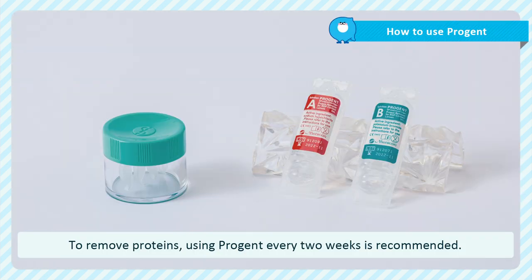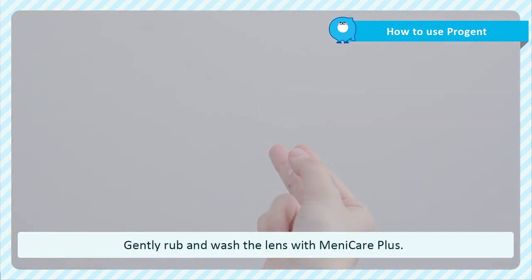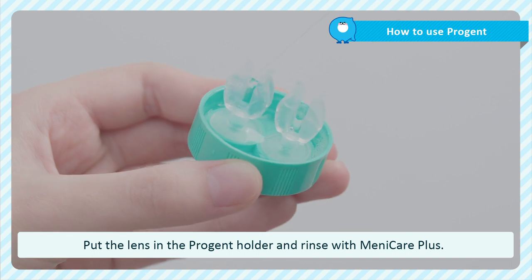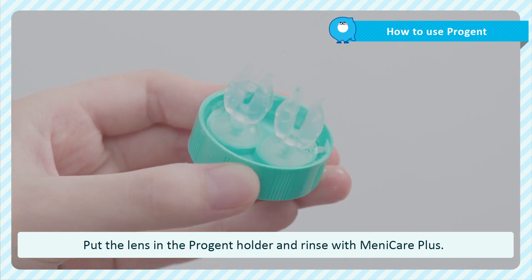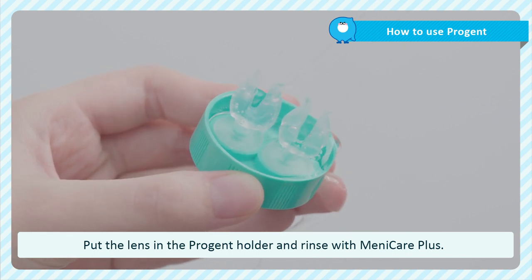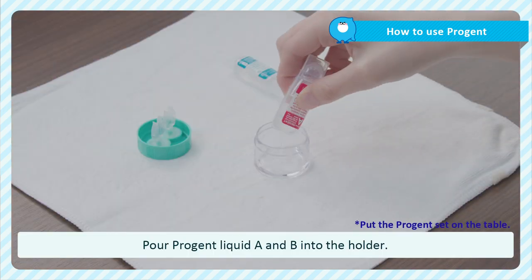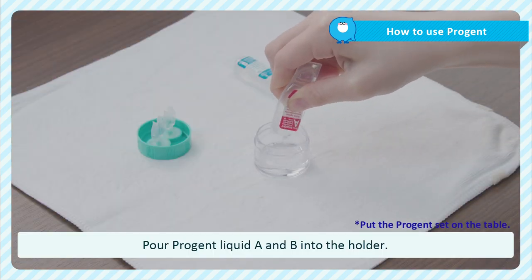You need to wash the lens every two weeks using ProGent to remove proteins from the surface of the lens. First, gently rub and wash with ManyCare Plus. Put the lens in the ProGent holder and rinse with ManyCare Plus. Then pour ProGent liquid A and B into the ProGent holder.